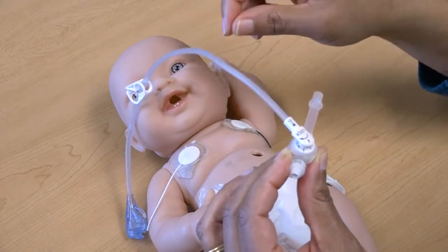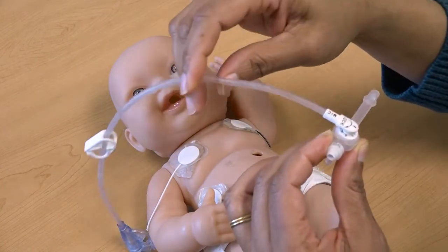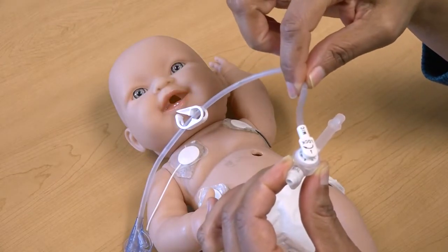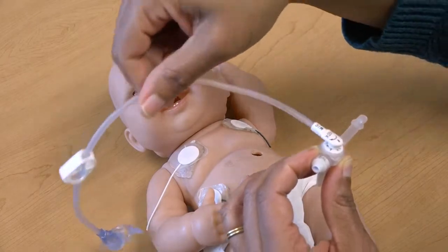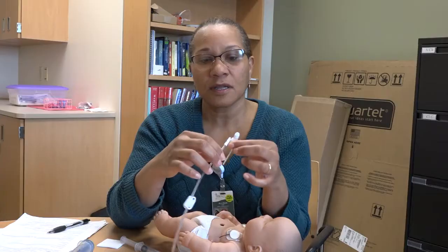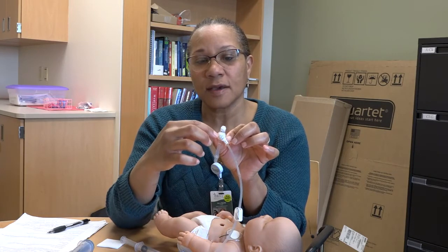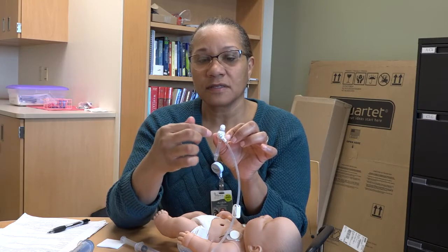When you reach resistance, you do not want to turn this extension tubing past that area. That's considered the lock position. But at the same time, it can move a little bit, but that is considered a lock position. And the reason why you don't want to turn past that point of resistance is it can damage the anti-reflux valve that's inside the tube.